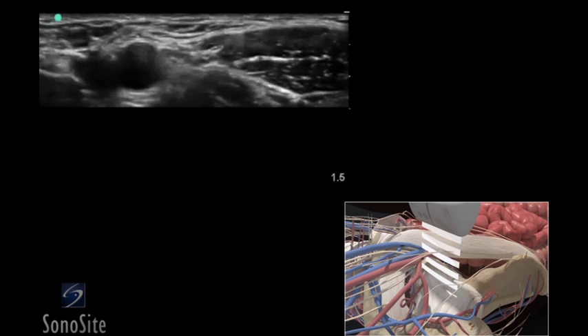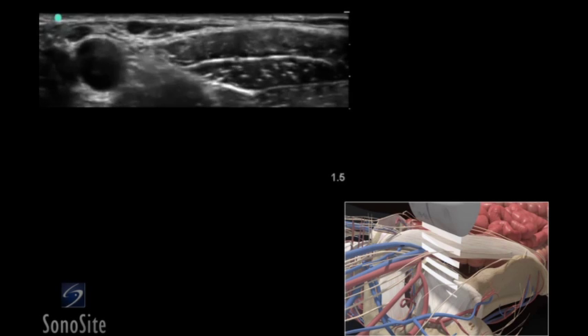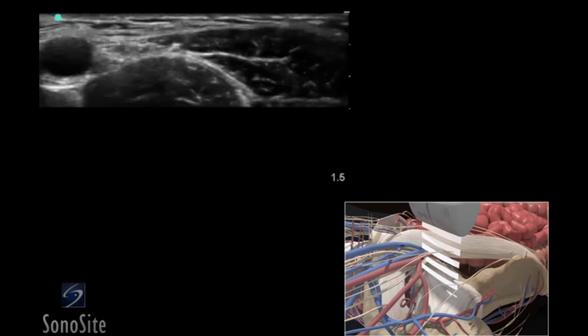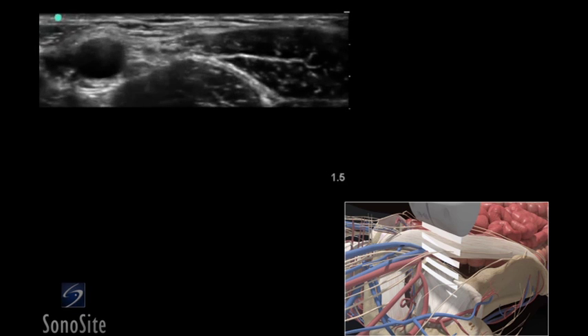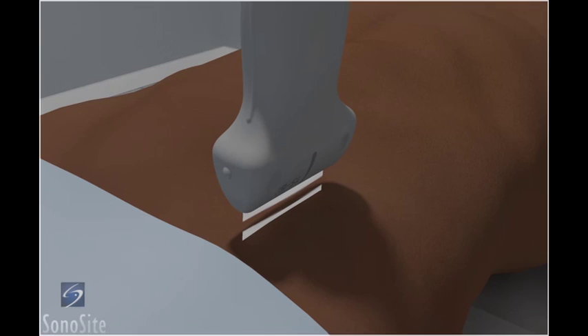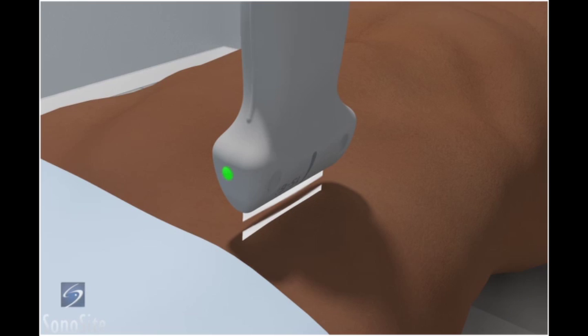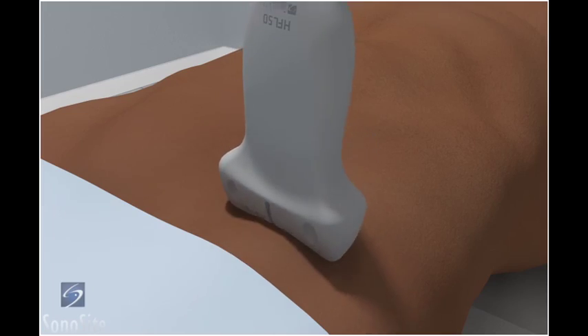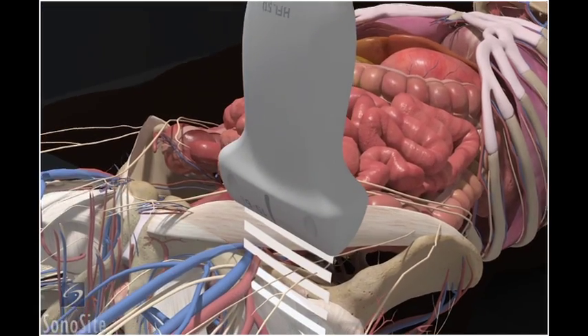A linear array transducer with a nerve exam type is used to perform an ultrasound-guided femoral nerve block. The target depth is approximately 1 to 3 centimeters in an 80-kilogram adult. The patient is placed in a supine position. The transducer is placed just superior to the inguinal skin crease with the orientation marker directed to the patient's right.